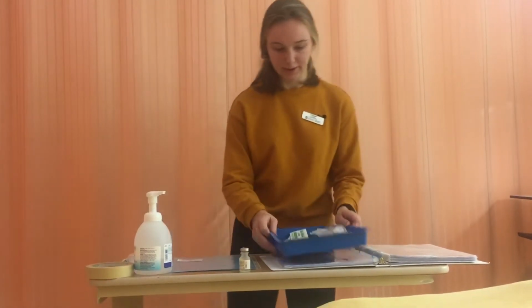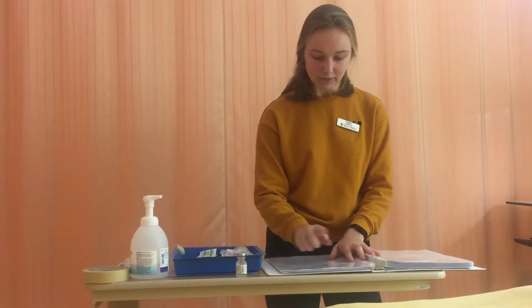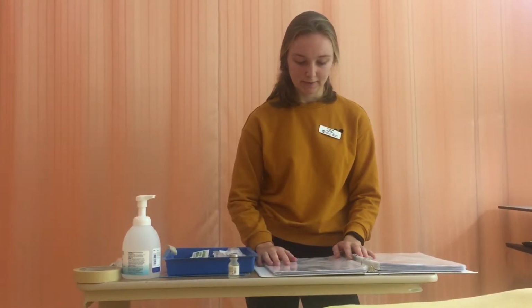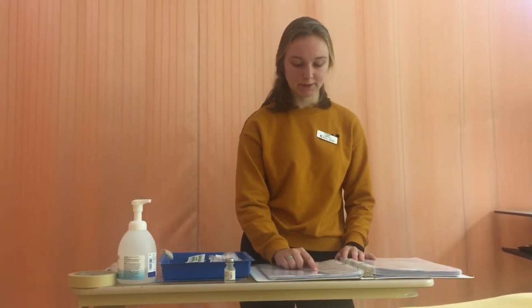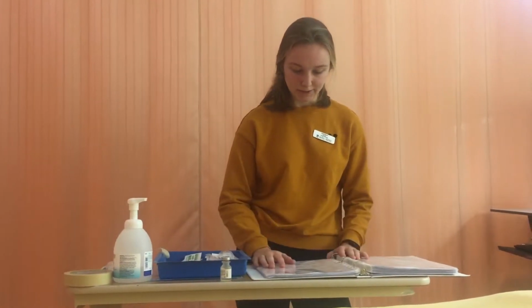So now I'm going to take a look at the parenteral drug monograph. So it says Penicillin G Sodium. The classification is antibiotic, so this is to help with her infection. It can be given by a nurse or a student nurse, and I'm a student nurse, so I can give this medication. The usual dose is 2 to 4 million units, and we're giving 3 million units, and the maximum single dose is 5 million units, and we're giving 3, so that means that it's within the normal range.